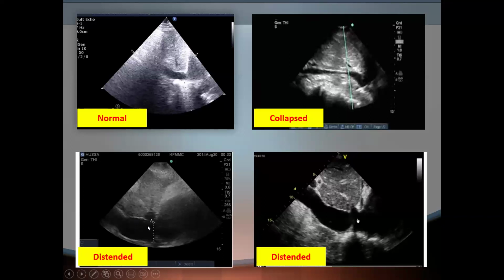If you use the static measurement only, as a diameter, you can be misled into thinking the patient may need fluid. So it is better for us to use the dynamic measurement, the distensibility index, which will give you more of a clue whether this patient is a responder or not. So as we said, again, don't rely on the static measurement. Try to use more dynamic measurements.